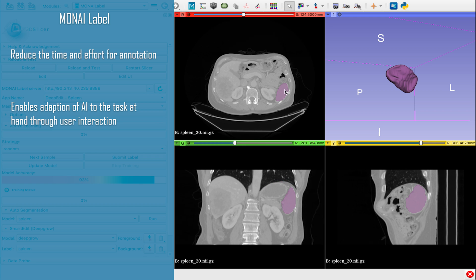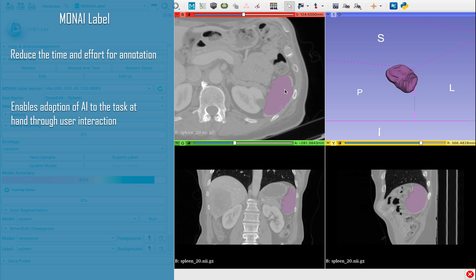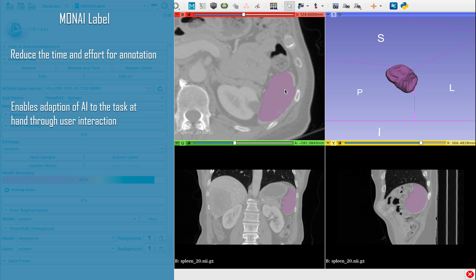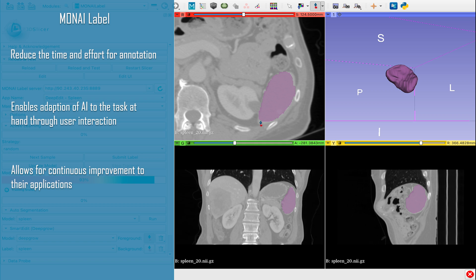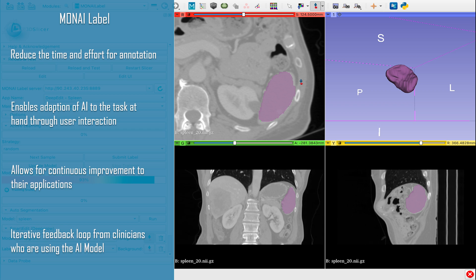MoniLabel powers an AI-assisted annotation experience, allowing researchers and developers to make continuous improvements to their application with iterative feedback from clinicians who are the end-users of this application.